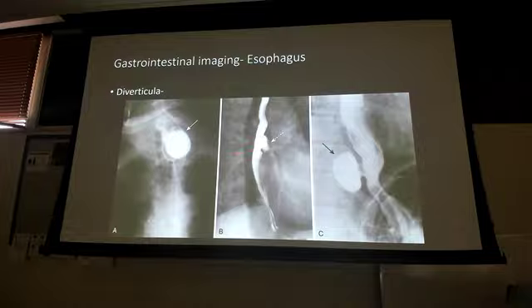And so they're actually able to squeeze it out, and they have a chunk of food from hours before. So these are some of the things that they're gonna come to you about and make you go, huh, maybe I should get a barium swallow study, or a video esophagography, because the odds are that they may have a diverticula there. Now, in this case, I would probably start with the barium swallow study because you don't know they have a diverticula yet. Remember that barium swallow is just looking at the structure of the esophagus. And then after you get this, depending how big it is, you may be more curious on, is that affecting liquids, solids, chewed food? I don't know yet. Let's take that next step and do the study of choice.